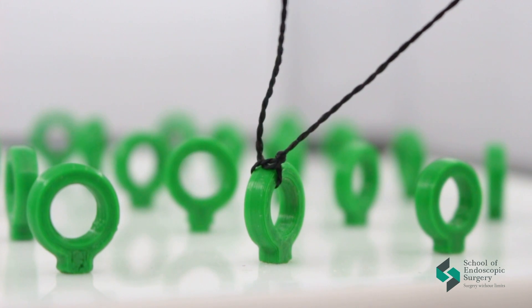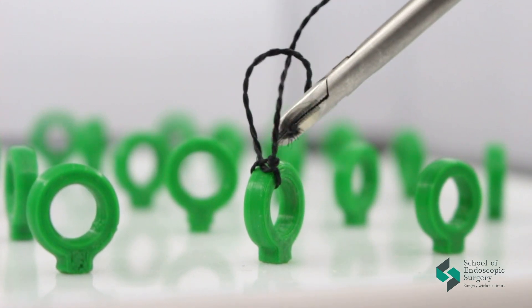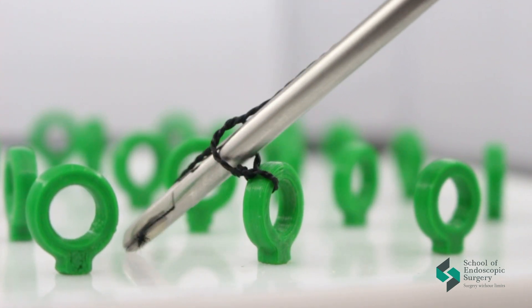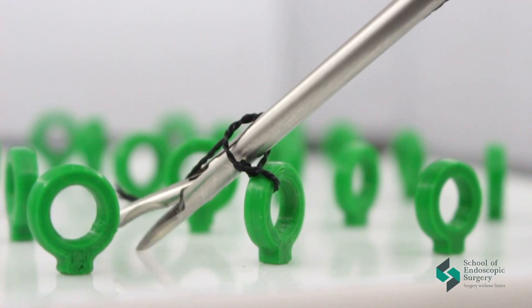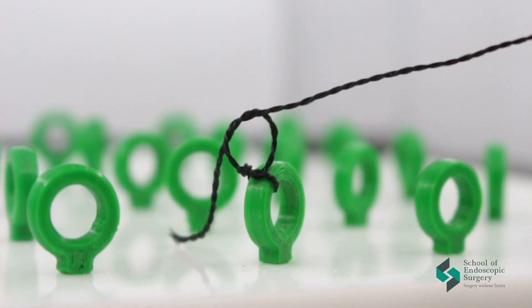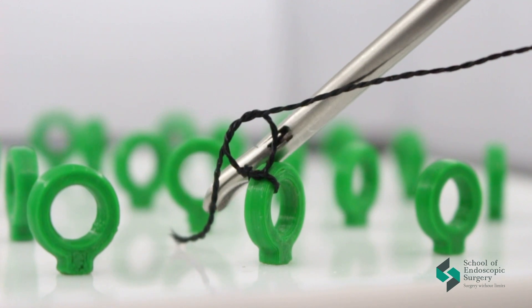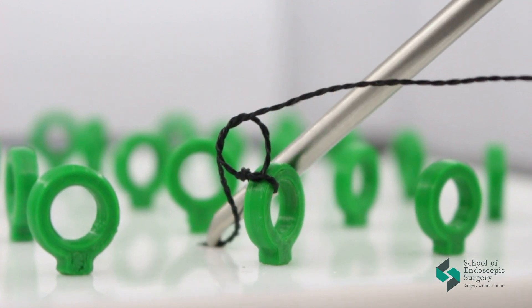Using our finger, we can feel how tight we have tightened the knot. After that, form a loop in the opposite direction. Put the thread through the loop, remove the instrument, and form a second knot by stretching the thread with your finger.